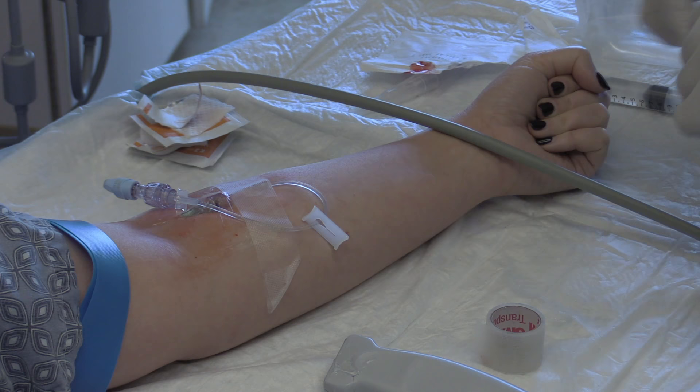Congratulations — you've achieved IV access with an ultrasound-guided peripheral IV. For more information, please visit www.physmini.org.